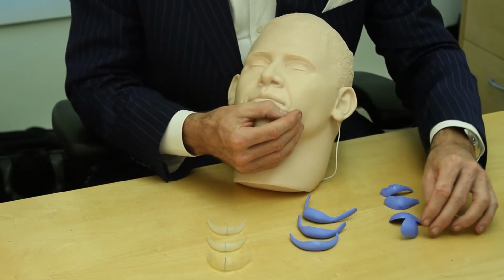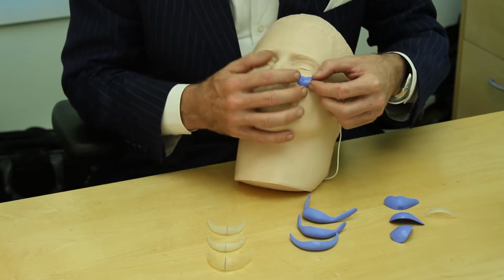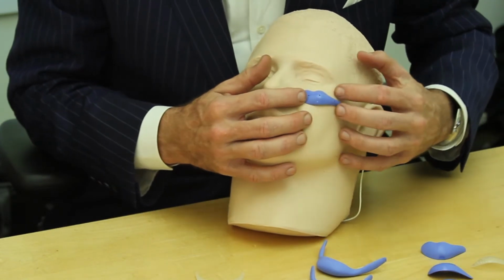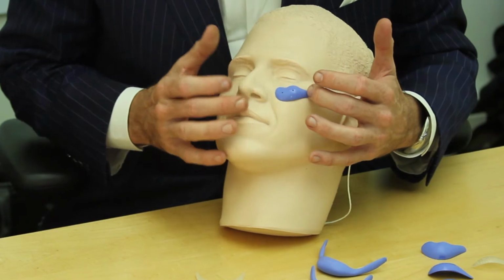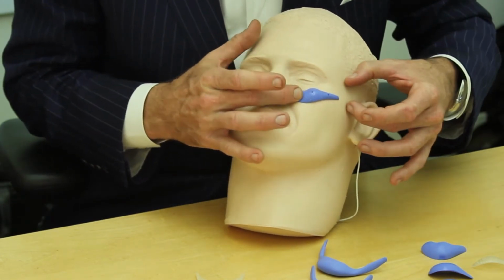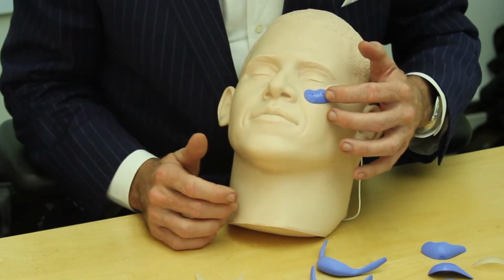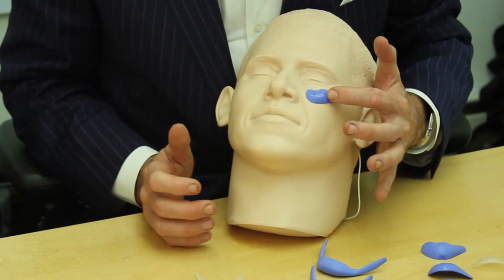The other types of implants that are commonly used, and again these are sizers and I'm just going to show you some examples, are implants that are really for malar or cheek augmentation. And there's a little notch in them to accommodate the small sensory nerve that comes out here, and we want to avoid that. And this one is specifically designed as a way of augmenting the cheekbone as it comes out to the side here, and also to give a little more fullness to the mid portion of the face.